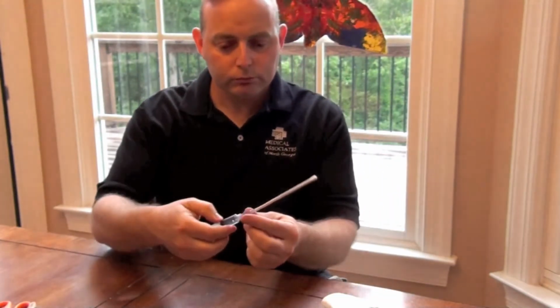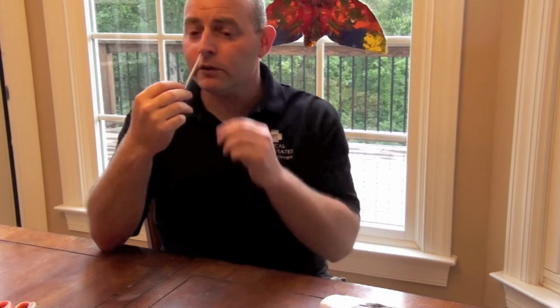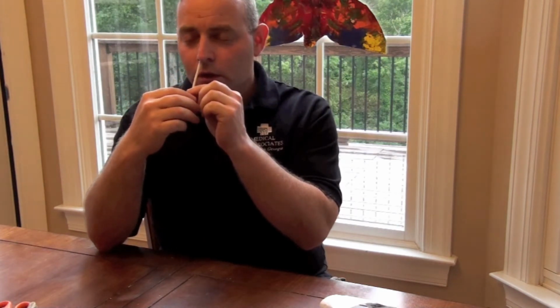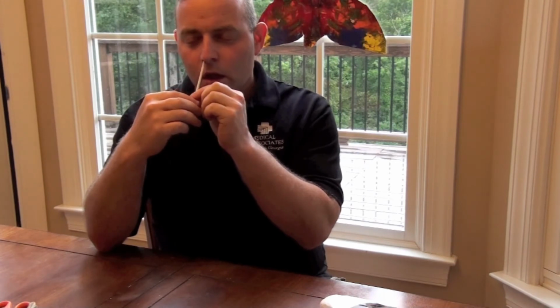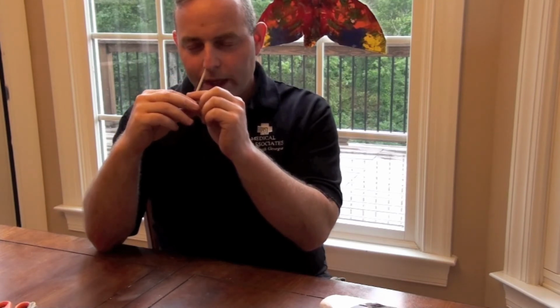Have a timer nearby, so once the procedure is underway, I like to leave it in for 20 minutes. And this gently will twirl down the nasopharynx a fairly long way. And since it's anesthetized, you barely feel it. And sometimes it takes some wiggling to get it past.